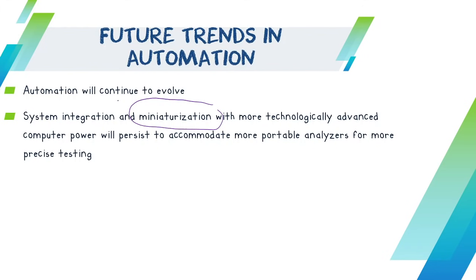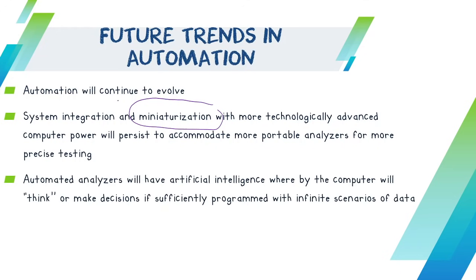And as of the moment, daghan na kaayo og POCT, which is also a trend in your automation. As much as possible, if possible, ang ato mga patients, these machines for testing are in their homes and they can process it themselves, so that is your POCT, your point of care testing. So that is one example also of the future trends here in automation, na dili na nila need mo adto pa og hospital to travel, na nadayon sa ilahang house.